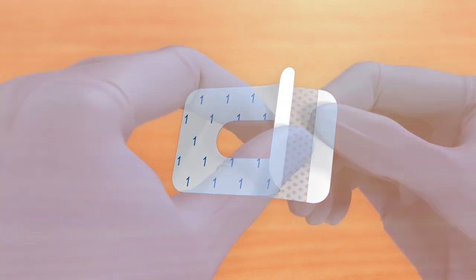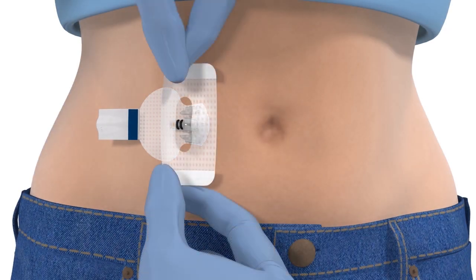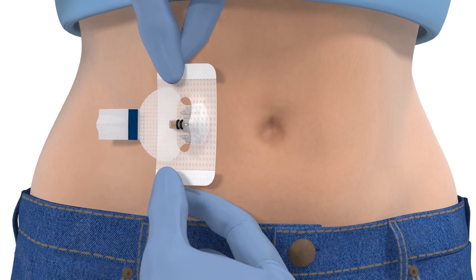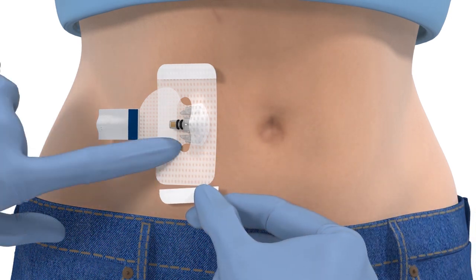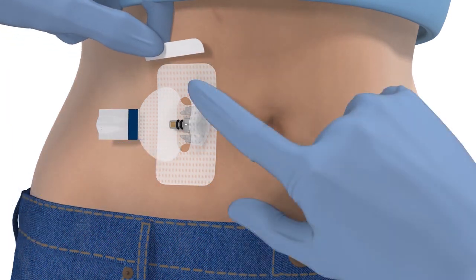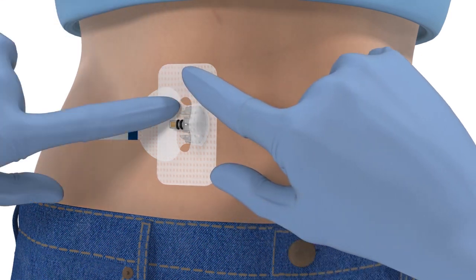Next you will need to apply the overtape. First remove the paper backing marked with a number 1. Hold the overtape by the sides and apply one side of the overtape so it covers both the sensor and the skin. Then stretch the other part of the overtape around the sensor connector. Smooth down the overtape, then remove the two paper tabs marked with a number 2. Press the overtape against the skin.